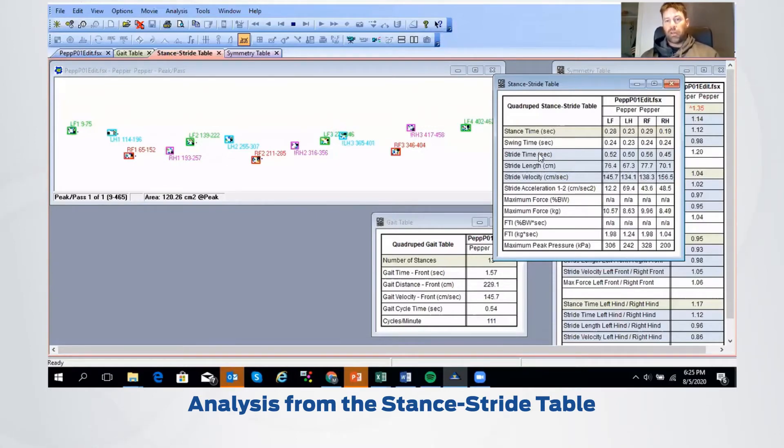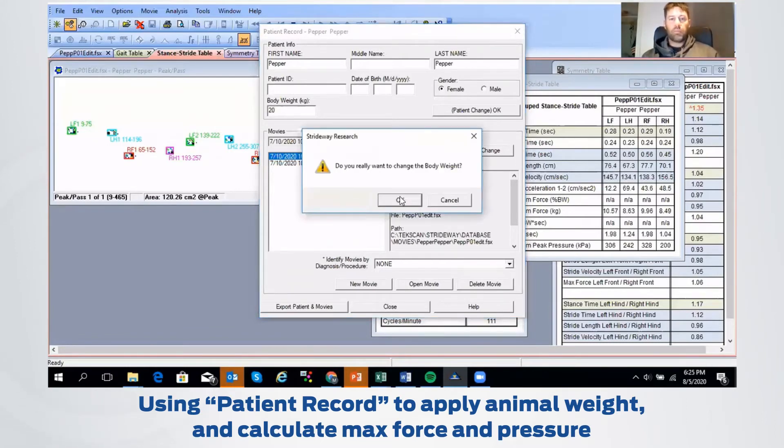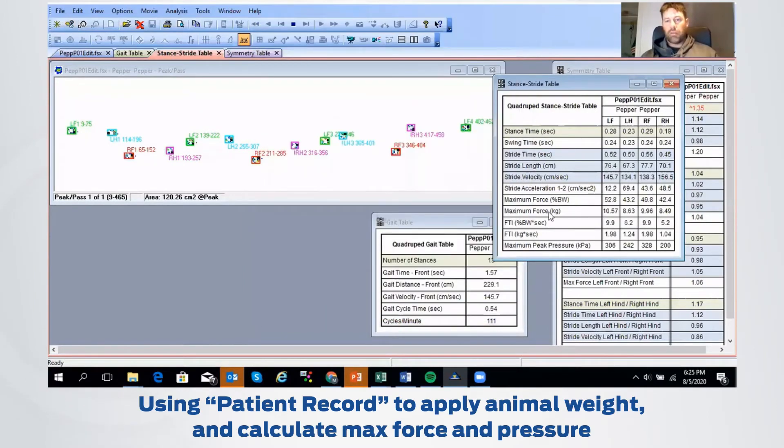You can also get swing time information and stride time, looking at left front versus right front to determine if there's a big difference. We can get down to stride acceleration and maximum force as a percentage of body weight. If you know the weight of the dog and place that into the patient information — if I just open this up and go into patient information and put the body weight there — you should see a change occur. Now we can see we get a maximum force as a percentage of the body weight. You can see the left front is producing a little bit more force than the right front, which could be due to her pulling in one direction.